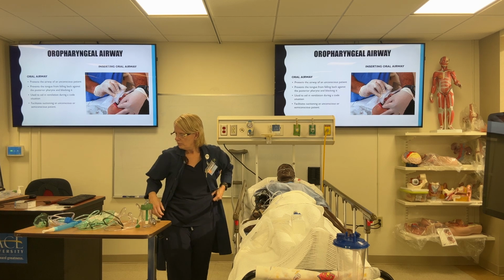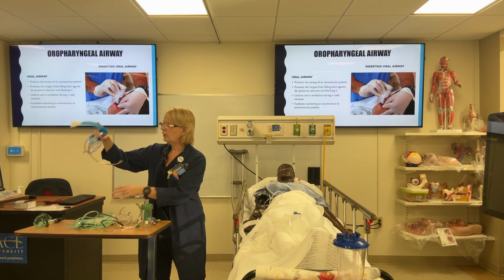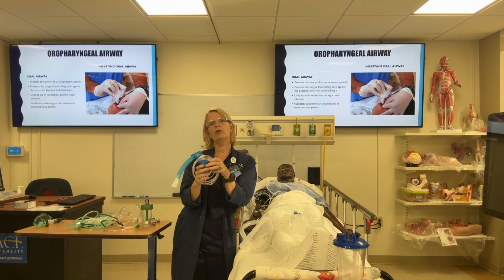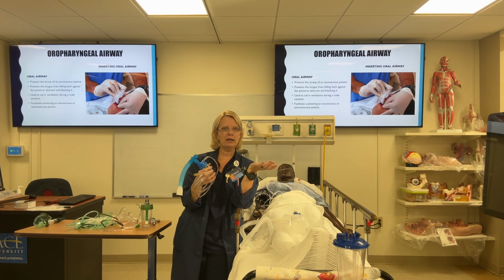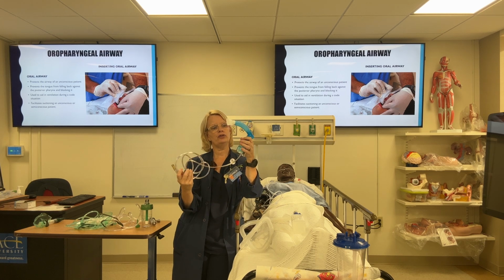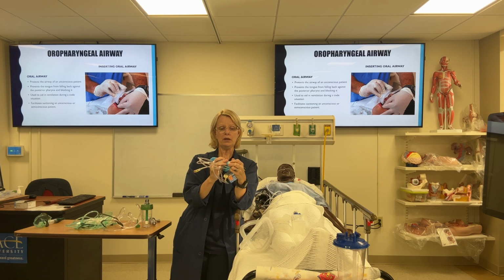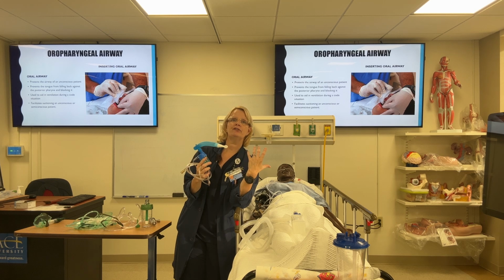Now, other devices that you might see that might be considered a high flow might be a nebulizer treatment, or again, if your patient is intubated and on a ventilator. Sometimes you see patients getting connected to albuterol, maybe they're wheezing, they're having a lot of trouble breathing, and you want to give them a little bronchodilator treatment. We use albuterol for that as a rescue med in the hospital.